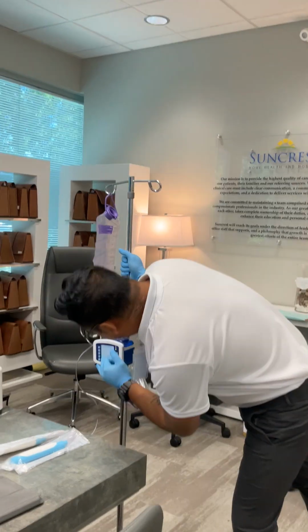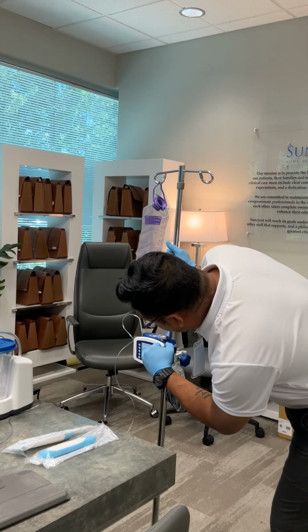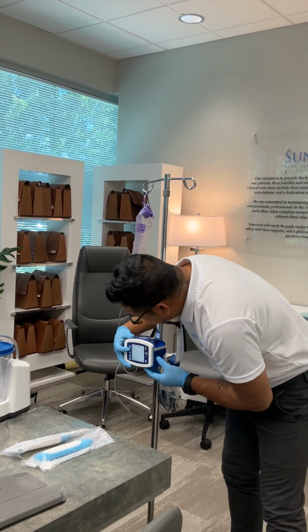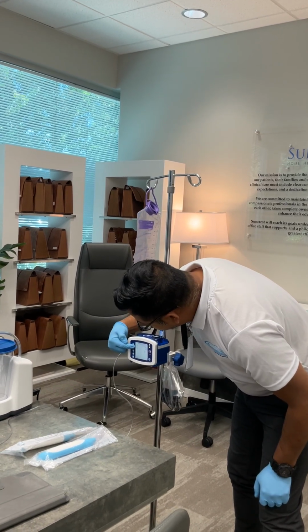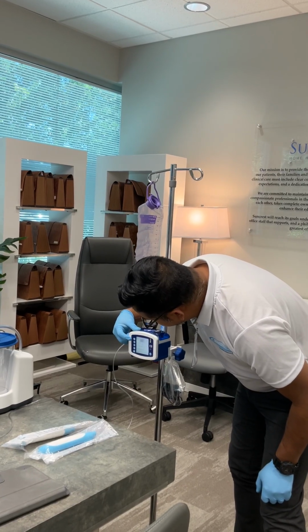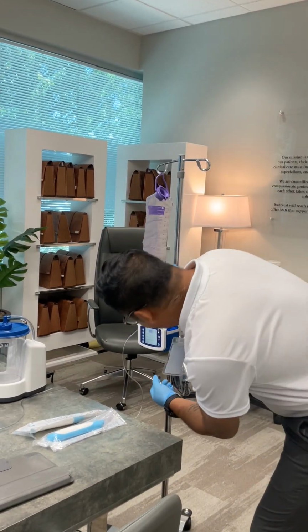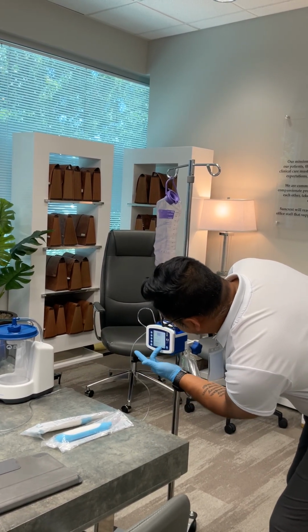Now, I know it's kind of hard to see. There's a couple of buttons on the left side, but there's little writing right there that tells you what it's going to do. One says prime the pump, one says adjust the feed. If you press adjust the feed, then it'll say feed rate or volume to be delivered. If you want to adjust the feed rate, you click on the arrow next to it, and then you'll see the ones place, the tens, and the hundreds. That's in milliliters.